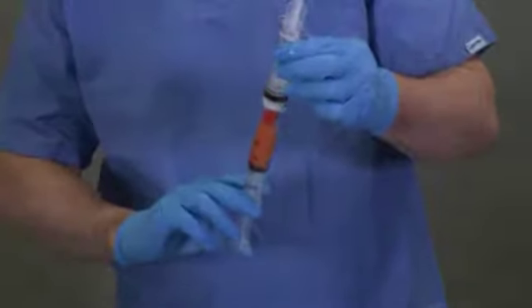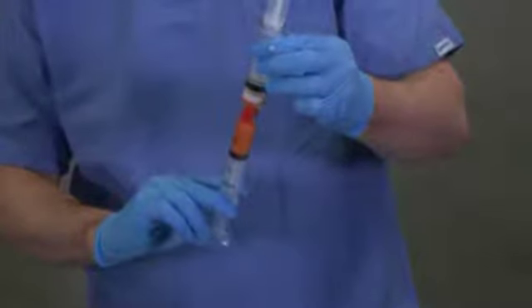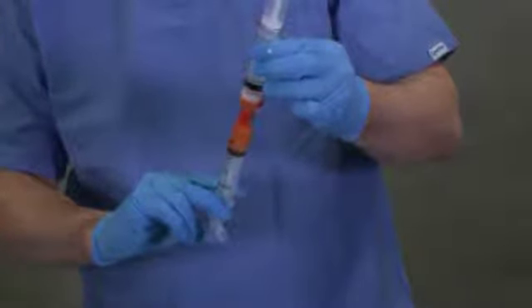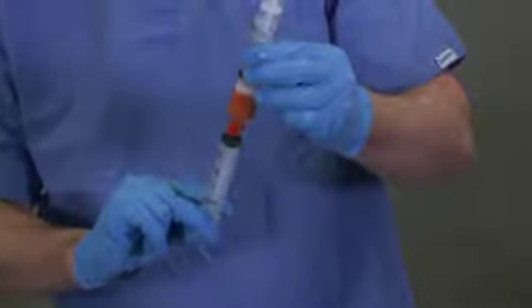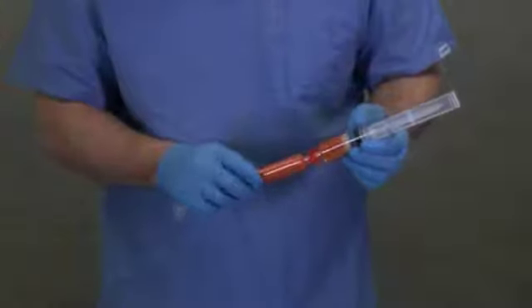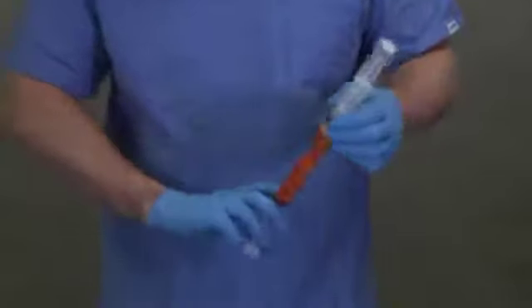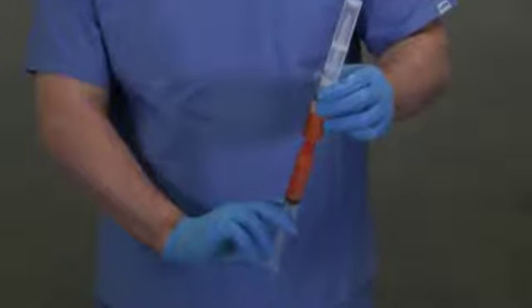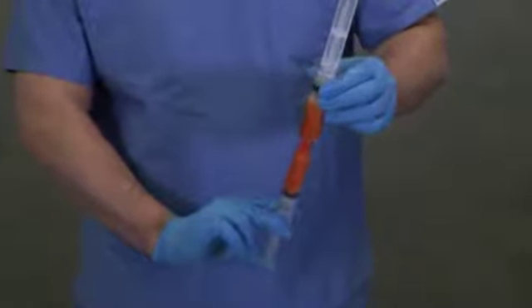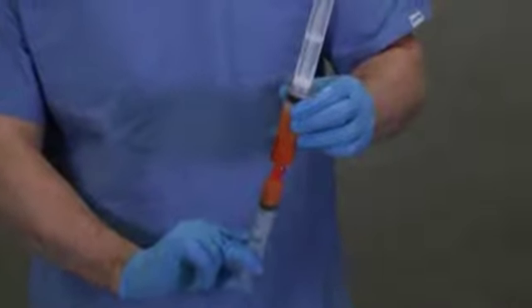Position the connected syringes so the collection syringe is on the bottom, vertical to the process disposable. Expel the lipoaspirate sample into the process disposable. Repeat the sample transfer steps for the second collection syringe until the process disposable is completely filled. If the process disposable is still not completely filled after transfer of all the lipoaspirate, fill the remaining volume with sterile saline.